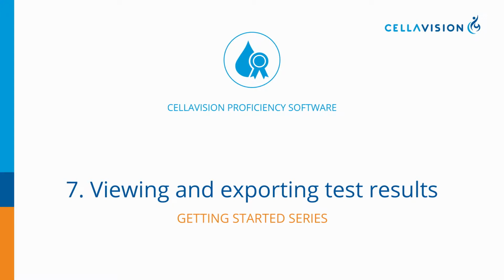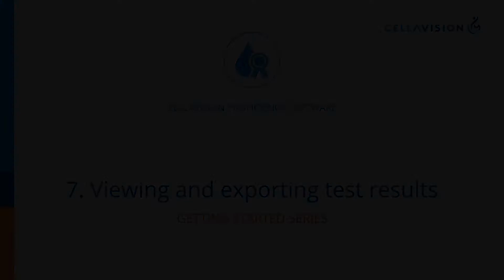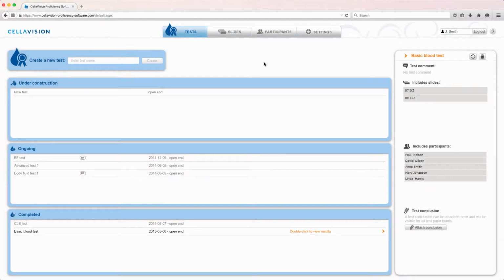In this tutorial, we will show you how to view the results of completed proficiency tests and how to interpret the various result statistics. Note that the interface shown here is that of an examiner account, but that the explanations of the different result views also apply to participant accounts.